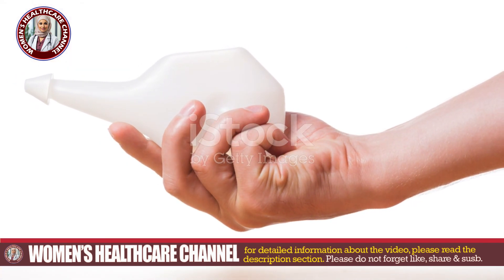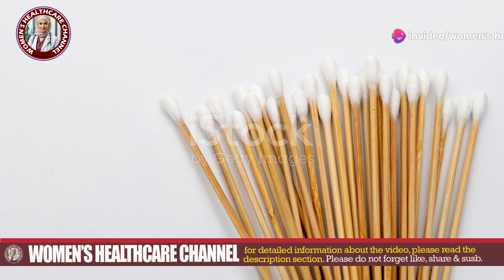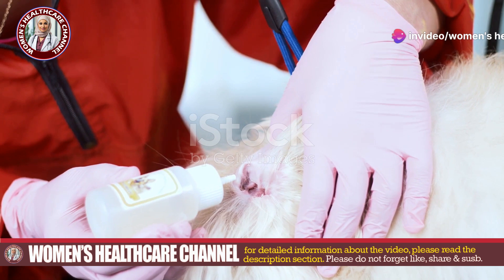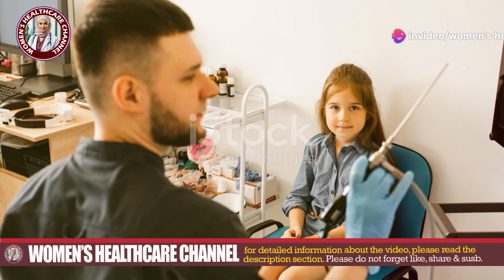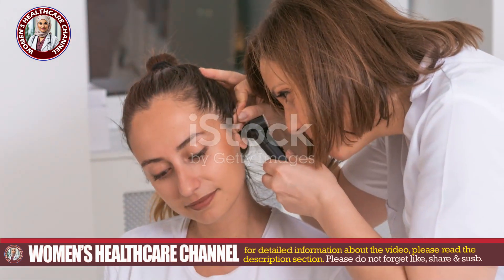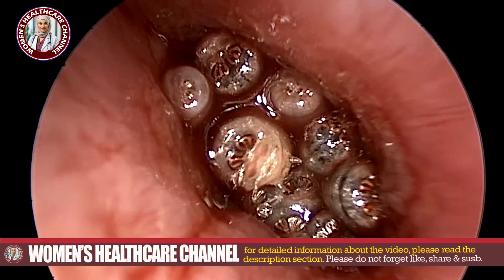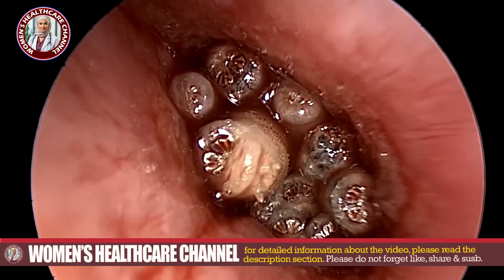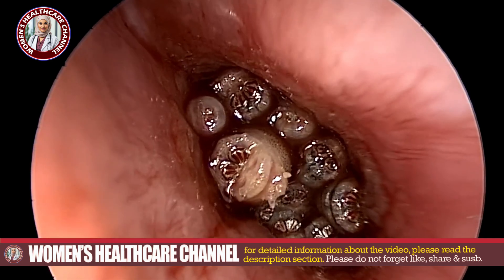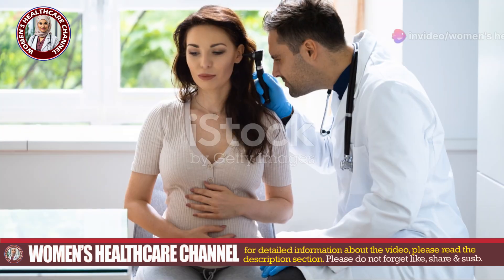Post-removal care is crucial. Perform a final irrigation with normal saline to ensure the canal is clean. Apply antibiotic ointment to prevent infection. If there are signs of infection or inflammation, prescribe antibiotics and provide pain relief if needed. Schedule a follow-up appointment to re-examine the ear canal and ensure all maggots are removed and there are no signs of infection. Advise the patient to report any persistent pain, discharge, or hearing loss.